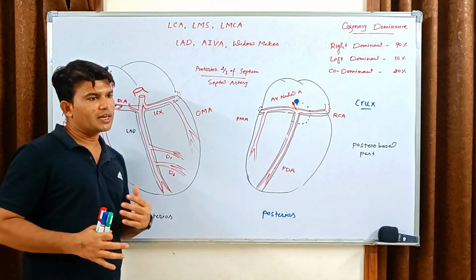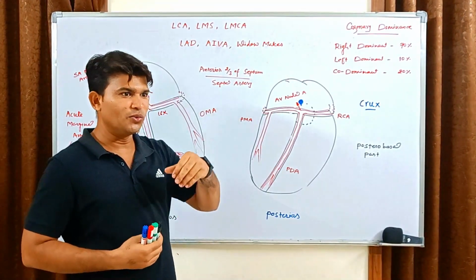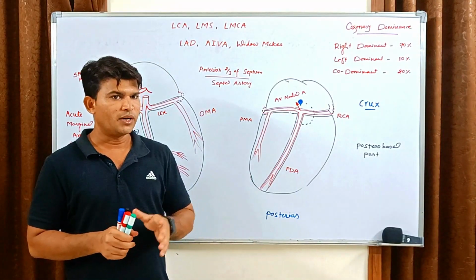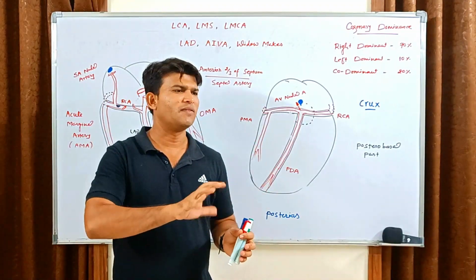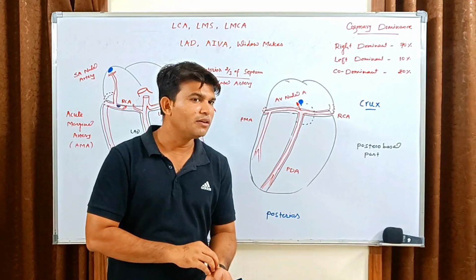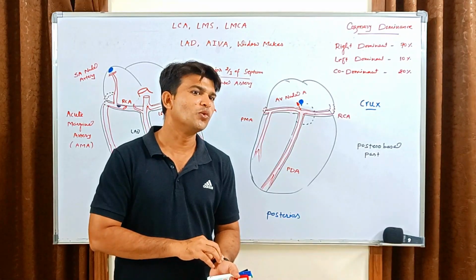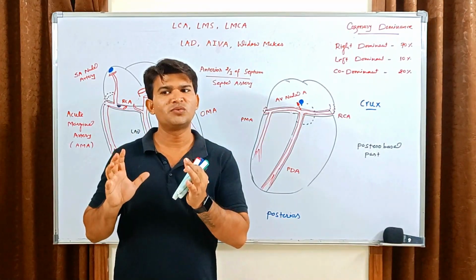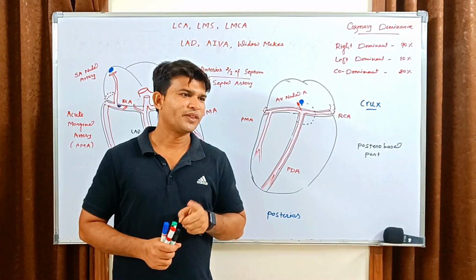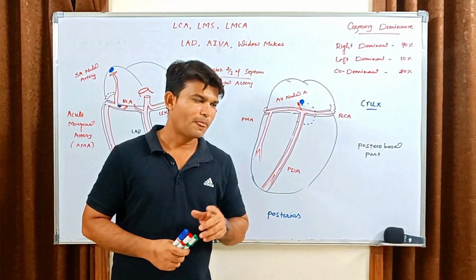If a patient comes with classical signs and symptoms, you do a 12-lead ECG. Even if you have not done the ECG, but you are clinically judging that the patient has classical signs of a cardiac event, ideally during chest pain or anxiety the heart rate should go up. But if you see the heart rate going down, then clinical sense should tell you that if the patient is having MI, which wall should it be? It should be posterior-basal or inferior wall MI, right? Very good.